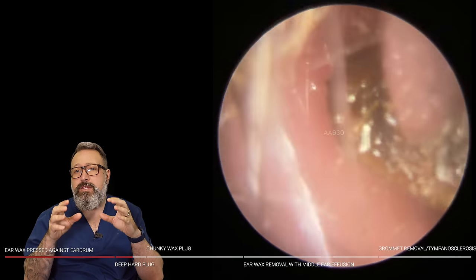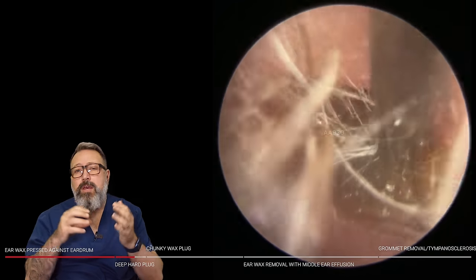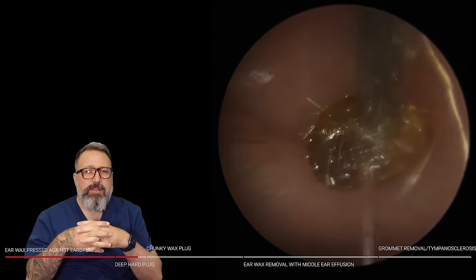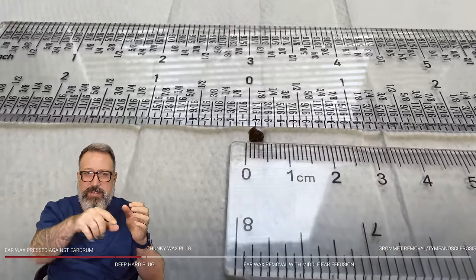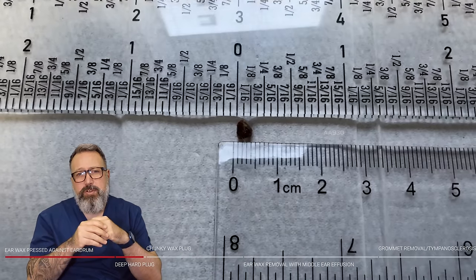There's lots of olive oil in here, especially with these deeper, drier plugs of wax that are right on top of the tympanic membrane — you want to be really oiling those up. You don't want any pulling against the membrane if you can help it. Out this comes — it was nestled right down into that anterior recess, the little dip just in front of the eardrum.